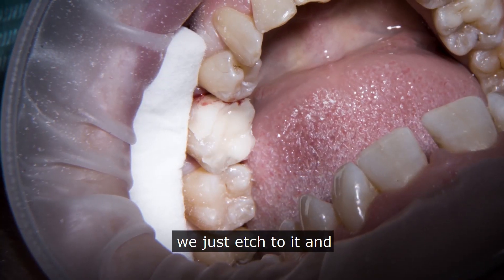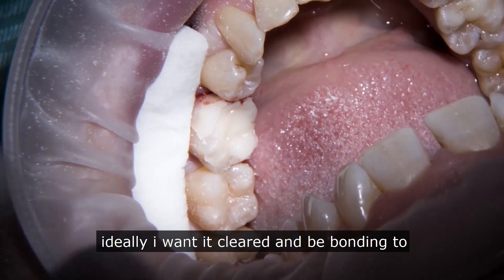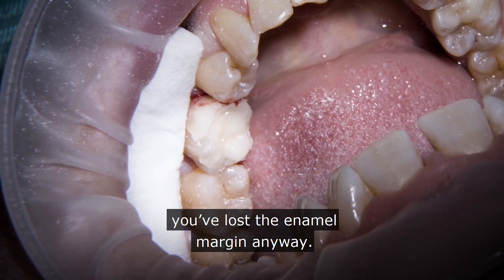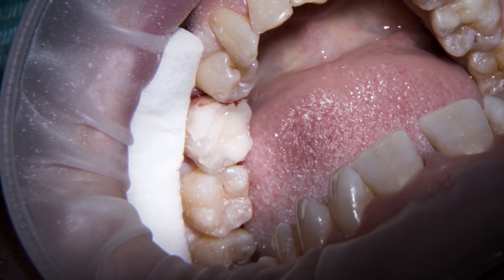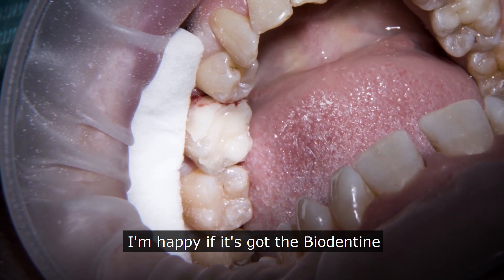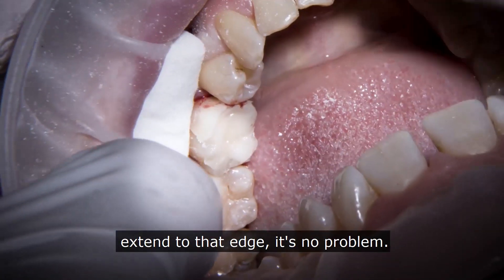Actually, I don't mind if biodentine is in there at the margins — we'll just etch to it. Ideally I want it cleared and to be bonding to enamel, but if you're right down there and you've lost the enamel margin anyway, I'm happy if the biodentine extends to that edge. It's no problem.